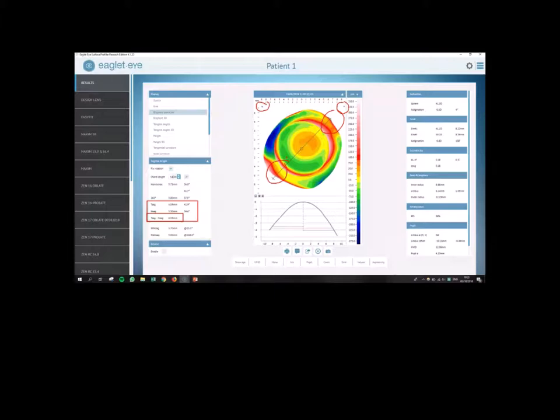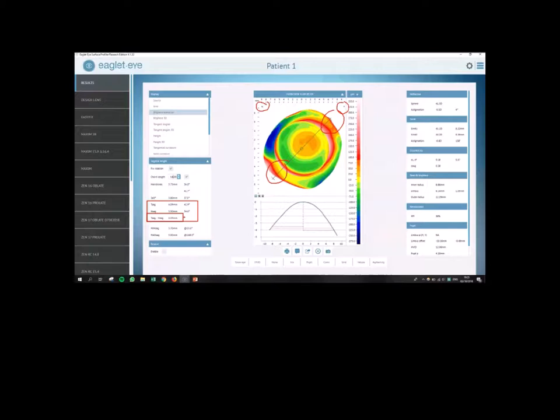So that means there's a difference in that nasal section and the temporal section of 590 microns, which is a lot. So when I see a difference like that, in my case, I would suggest ordering a quad specific lens. I know Zenlens has them available currently, possibly OneFit is working on that as well. So this is an indication on how to see if you maybe need a quad specific order. So I've been running through my examples right now. If I'm going a little bit too fast for you, feel free to shoot me an email after. And I'm happily explaining a little bit more stuff.